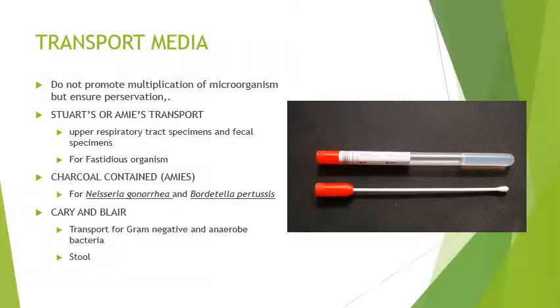Okay, next would be transport media. Transport media is used not to have the bacteria grow, but to keep the bacterial cell still viable after 2 hours. So, what are the transport media? Note this: they do not promote multiplication of microorganisms. This is purely preservation.